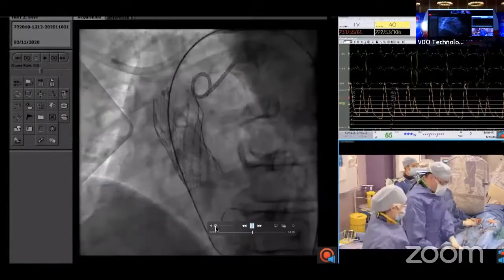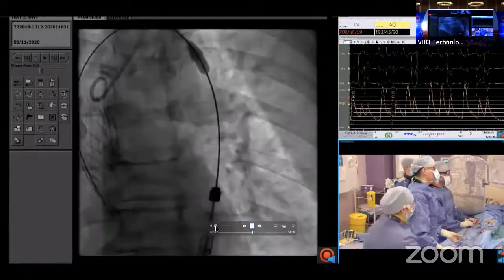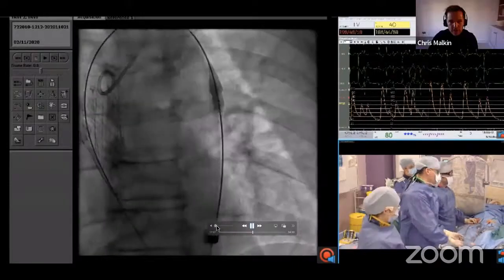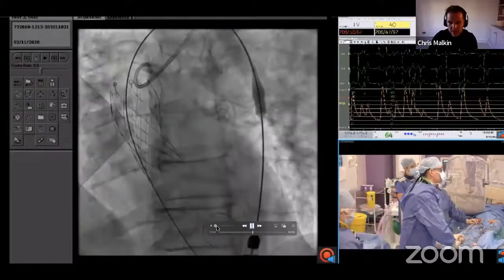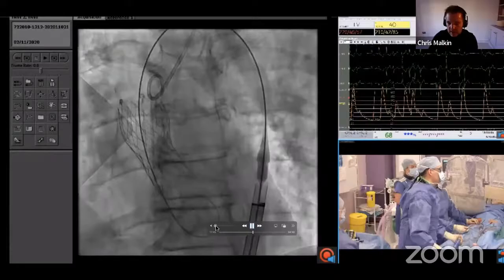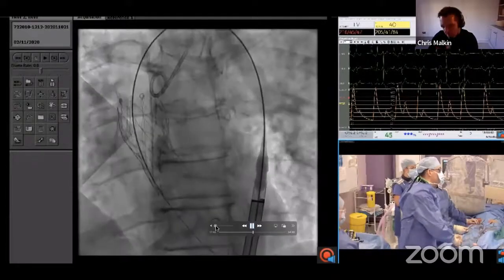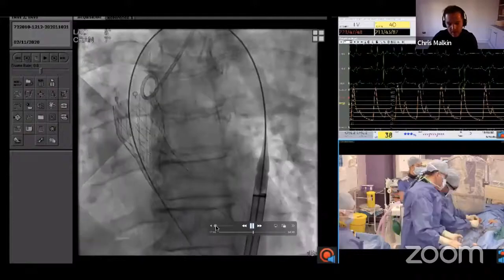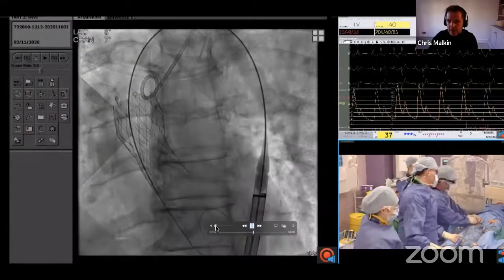So we keep LV access with the preformed safari wire. Recapture the capsule and the nose cone, as you can see here. And then we'll take out the whole integrated system and reinsert a short 16 French Cook. And if we need to do a post-dilatation, then we can do that, or perhaps we'll just assess the hemodynamics and see what the result is.